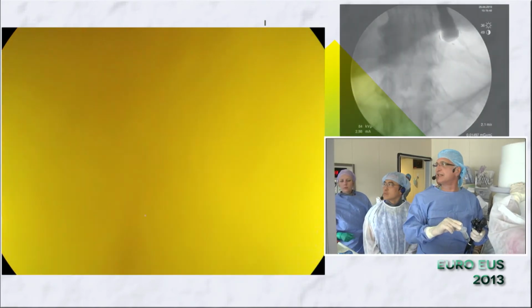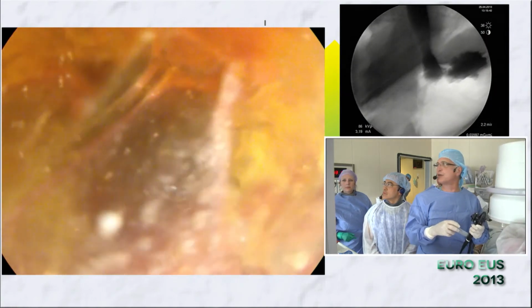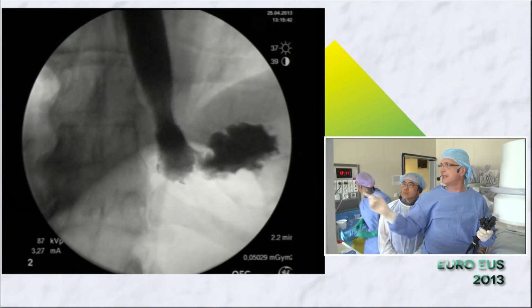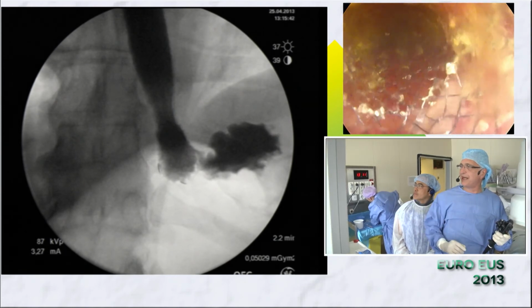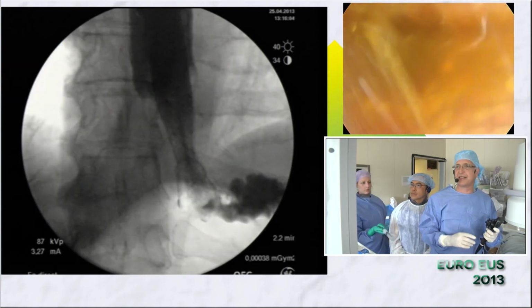And then now you can move. We will just check that we have a good position of the stent, and then we have a good flow towards the stomach. And what you see also is that the tighter part of the tumor is well covered by the distal part of the stent.